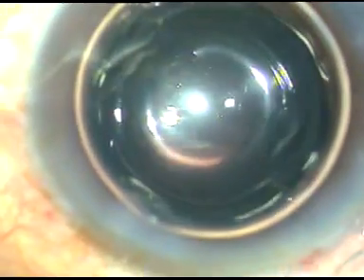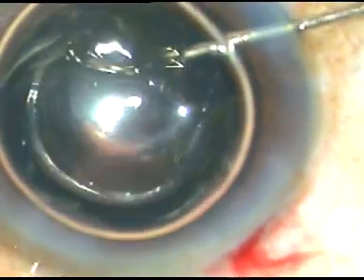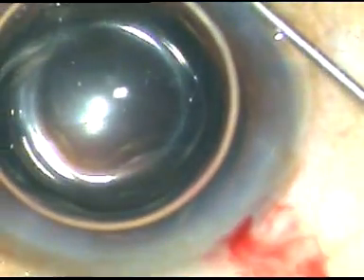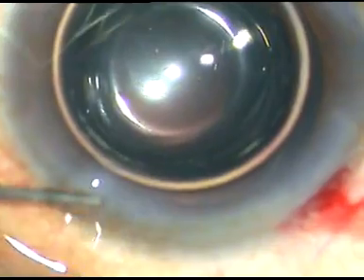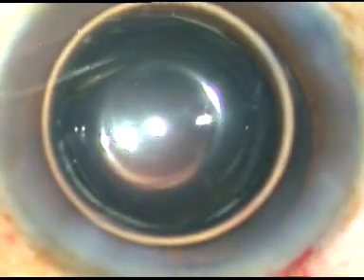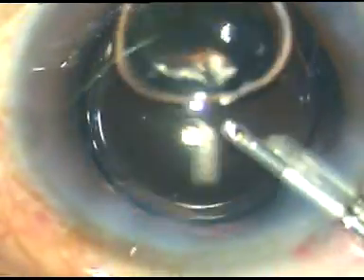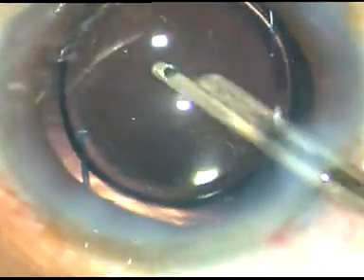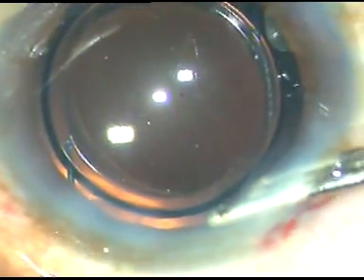Air is injected because the anterior chamber is getting very shallow. This is a bit of moxifloxacin. The side ports are hydrated so that these wounds become watertight — the stab incisions are closed by hydration of stroma. This is the final lavage of the anterior chamber. After lavage for some time with BSS — balanced salt solution — this is how I form the anterior chamber. Stay in the wound for some time and come out suddenly.